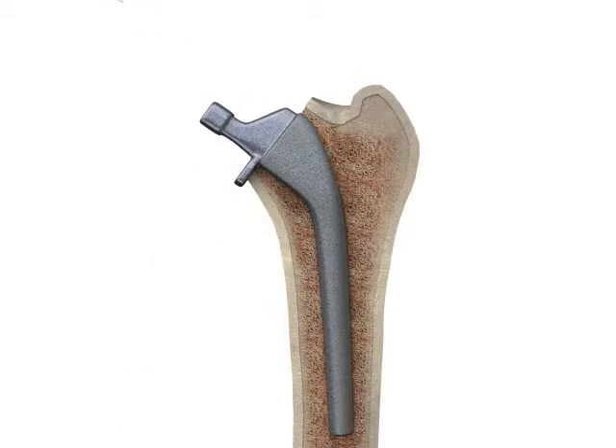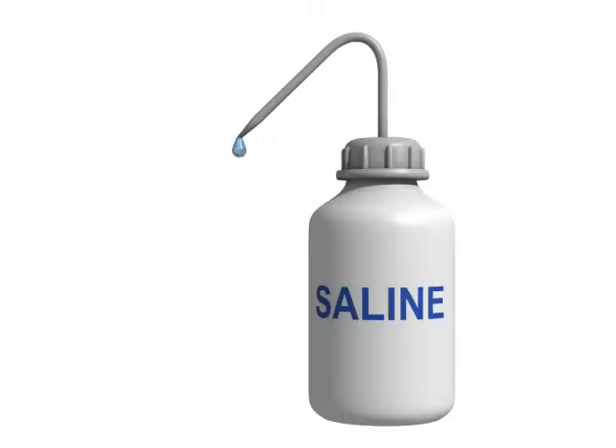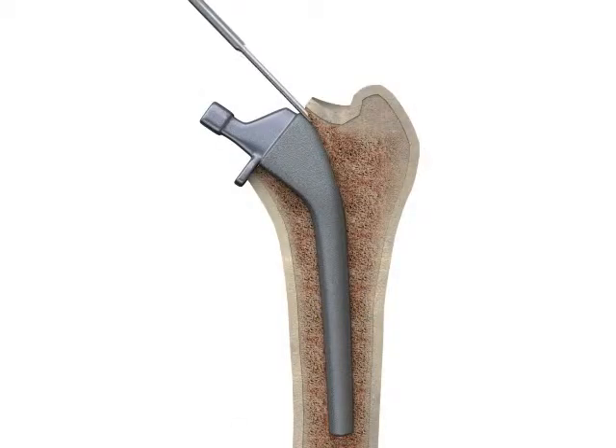It is important to maintain a steady flow of saline around the prosthetic stem during insertion of the flat osteotomes, particularly when cutting cortical bone. This ensures that the metal-on-metal interface is kept cool and lubricated whilst the active edges of the osteotome are cutting bone.